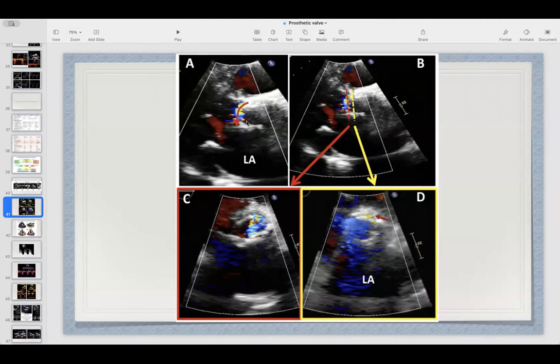I'm sharing now. You will put your parasternal view here, and then you do X-plane across this point, at the same side of the vena contracta. From that you will have the other image, which is usually this, and then you can trace it. Of course, you can also do it by TEE. I usually don't use 2D, I use 3D, and 3D would be more accurate, so I will use 3D.